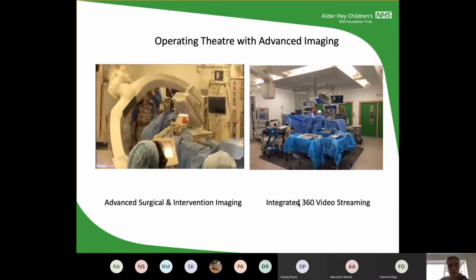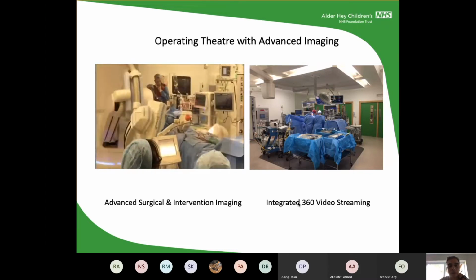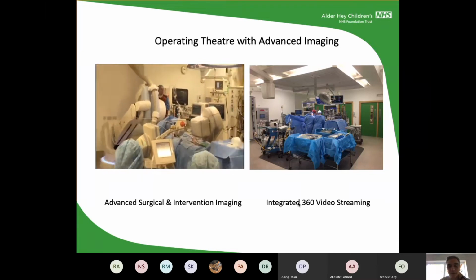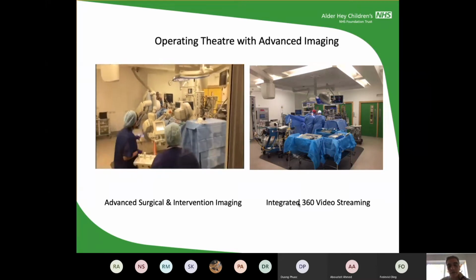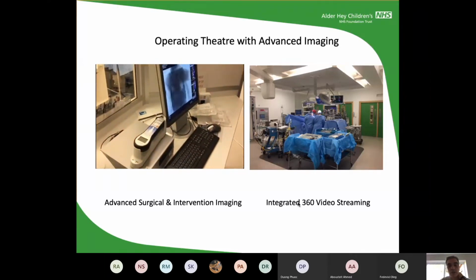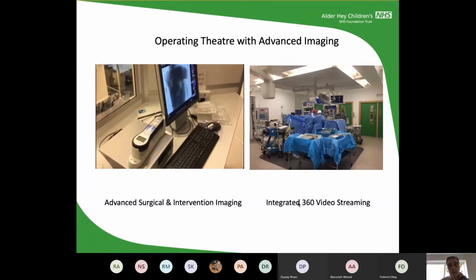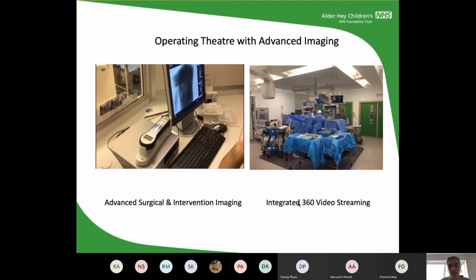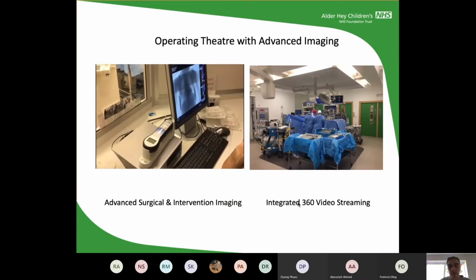So this was the first time that we used the hybrid, and as you can see, Annette is shouting because she was very excited. Yesterday they used the hybrid again, and what it gives you is different views of an angiogram and a CT, a Dyna CT, which is not a perfect CT, but it gives you an immediate view of the heart if we want to make decisions. It's far from perfect, but it's a lot better than before.